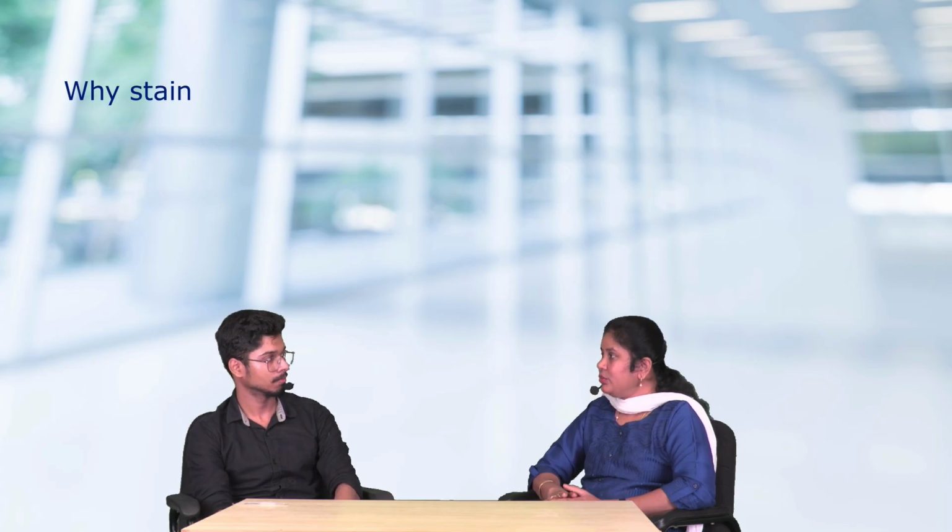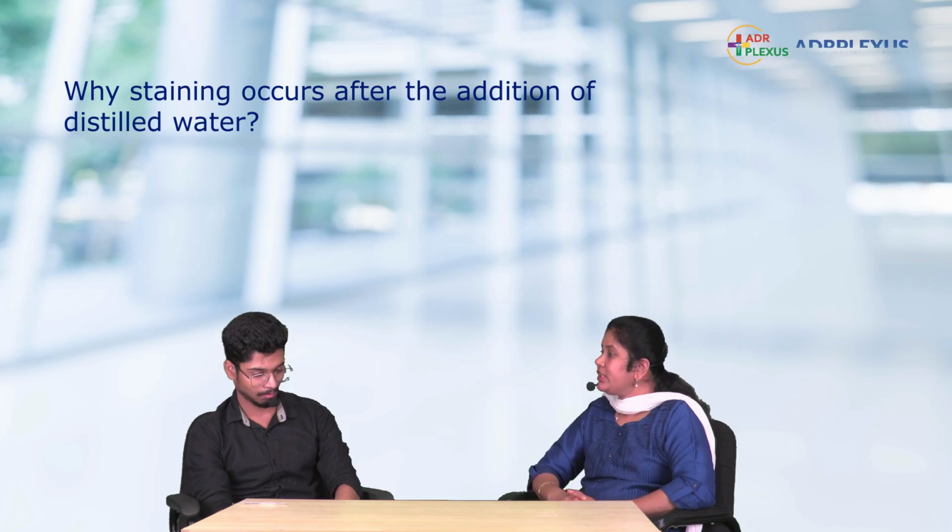Right. What is staining time? Staining time is 2 to 8 minutes, ma'am. It is the waiting time after adding the distilled water to the right smear. Why does staining happen after adding distilled water? After adding the distilled water, the dye gets ionized, thereby it penetrates into the cell and gives the color, ma'am.